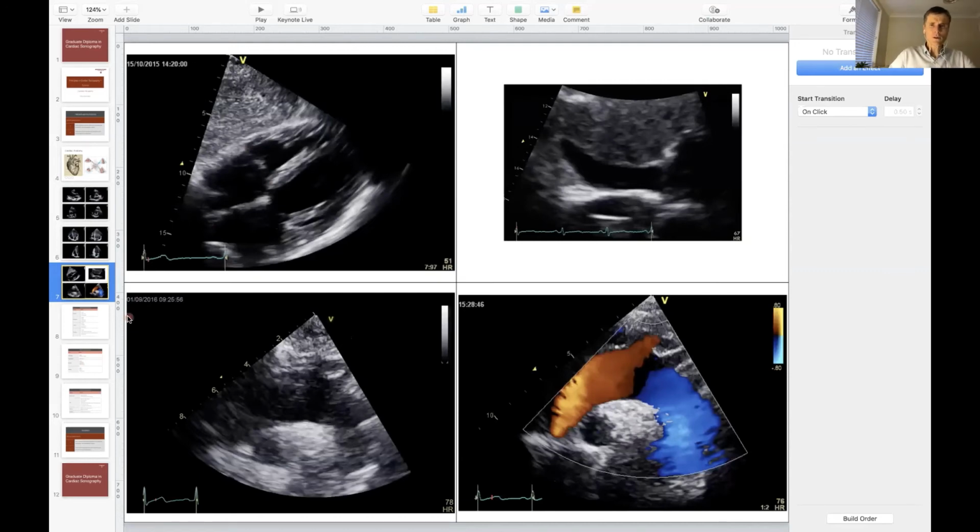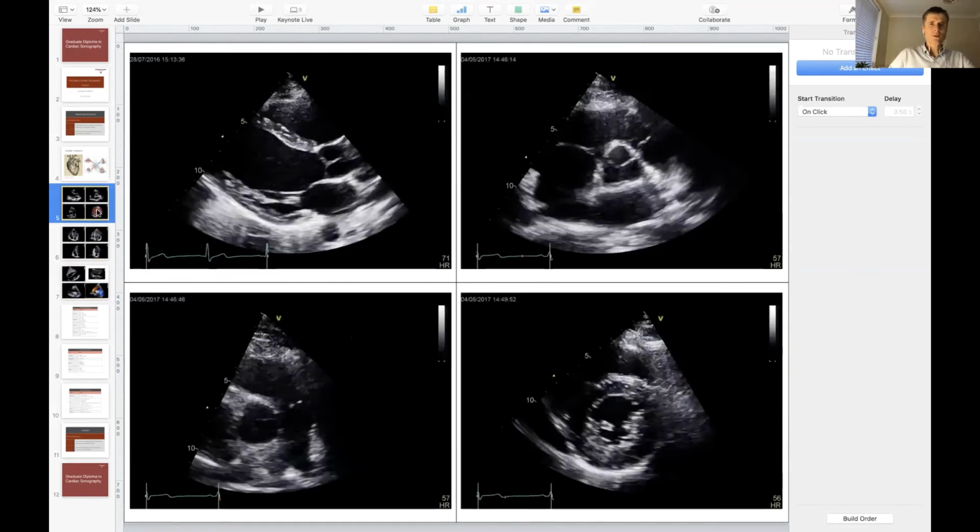Let's have a look at the pulmonary valve. Again, you're just starting out, and we don't want to be going too far ahead of ourselves, but what we can see in this parasternal short axis view is the pulmonary valve, right ventricular outflow tract, pulmonary valve, main pulmonary arteries, and branch pulmonary arteries. We can certainly appreciate from this particular view, and you can image the pulmonary artery from others, the motion of the pulmonary valve from that view.